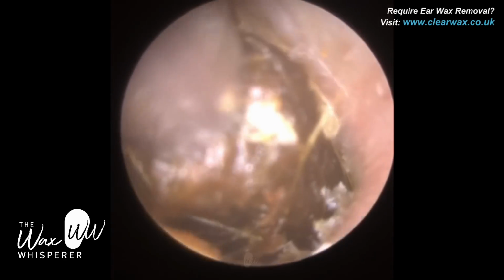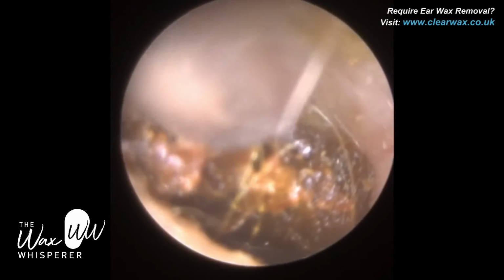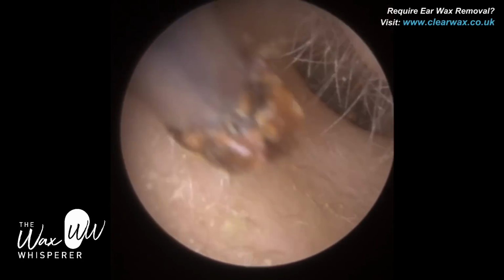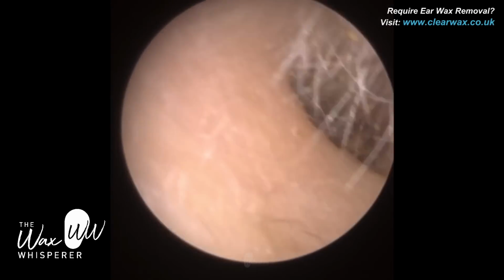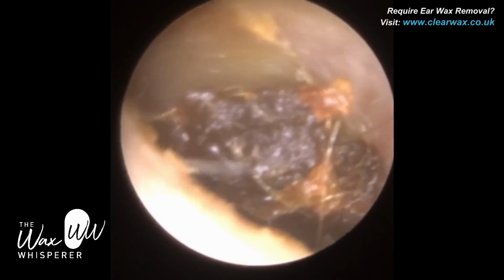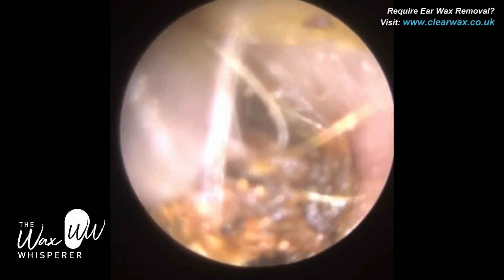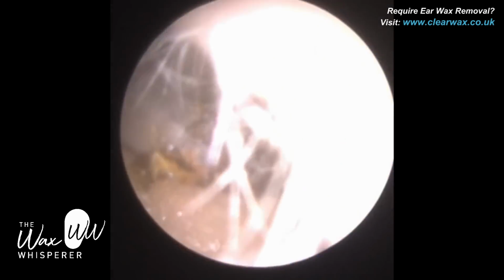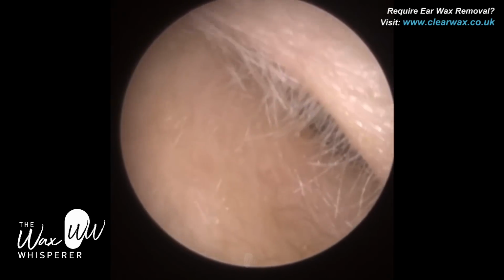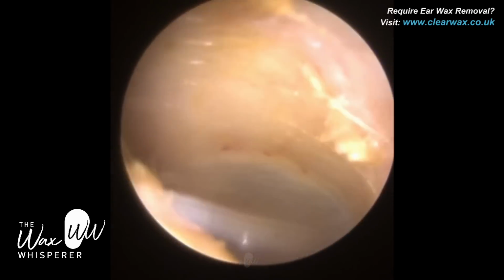Once we've stretched the ear, and we actually do that using the endoscope, we don't pull the ear back with our hands, or get the patient to do that, we do it ourselves with the endoscope. When we train our Clear Wax delegates, I always refer to this first part of the ear canal, the cartilaginous portion, as almost like a door flap. So we're lifting the door flap, we position the endoscope into the ear as a door stop, and that keeps the ear canal open and stretched, and we can then gently go in with the endoscope and mitigate the bend. You can just see how bendy this is.